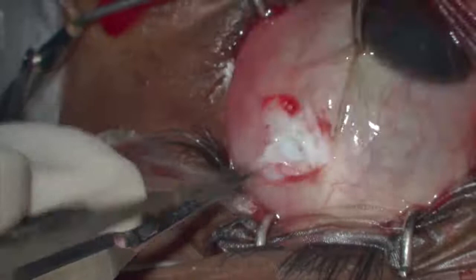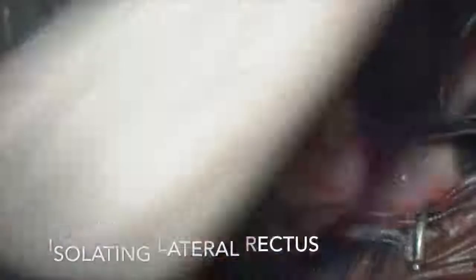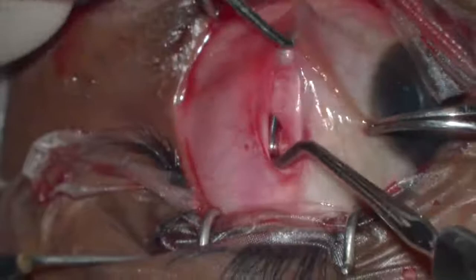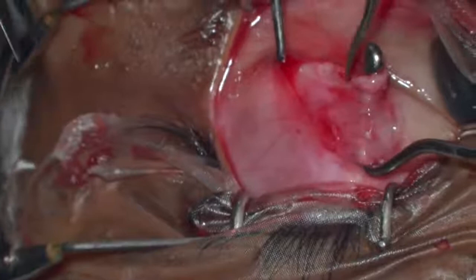The lateral rectus is then isolated and cleared from the overlying fascia. The posterior part is exposed with a malleable retractor.